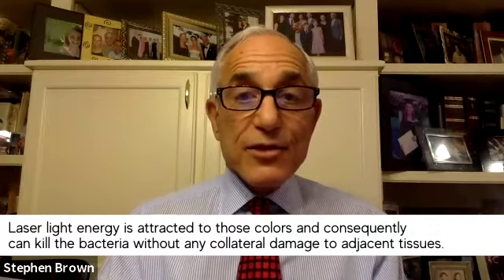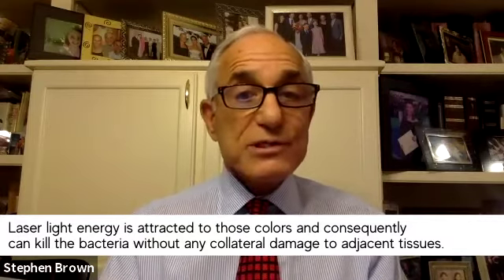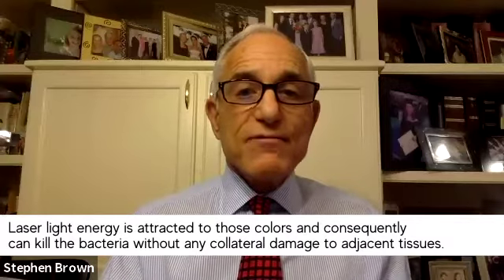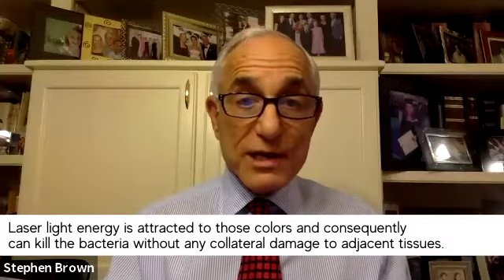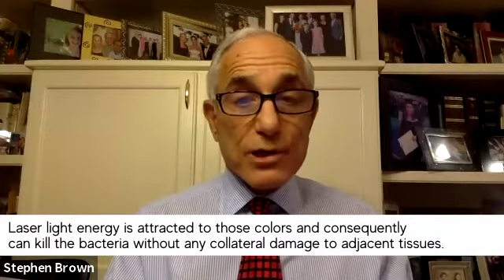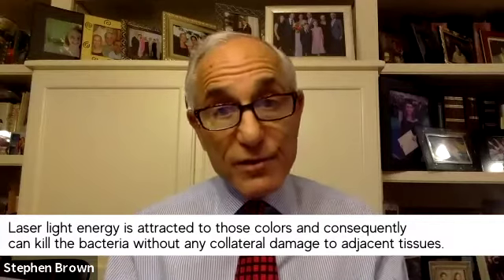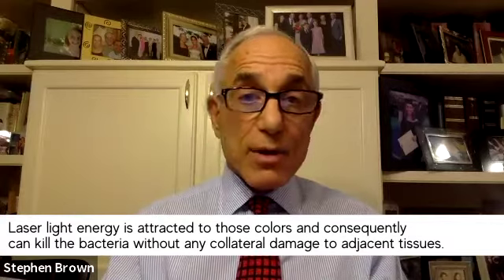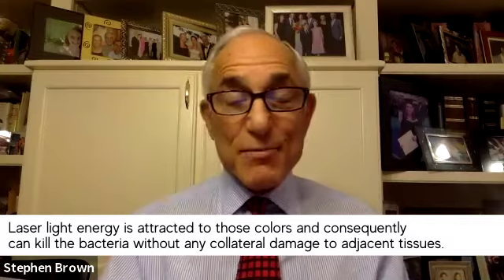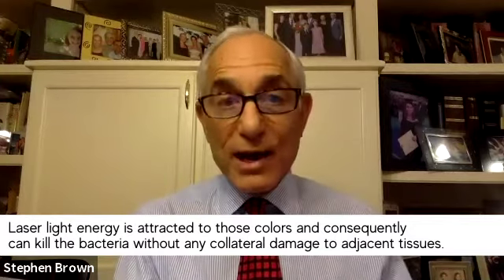In fact, the laser light energy is used to remove tattoos, and that's the reason they can do it, because of the colors of the tattoos. So this is a very non-invasive way of treating people, kills the bacteria, and then if we give them appropriate follow-up treatment, then this disease is not going to come back. And one of the things that we do during the follow-up treatment is routinely make new slides that they can see on the microscope, so the patient can literally see their disease going away.